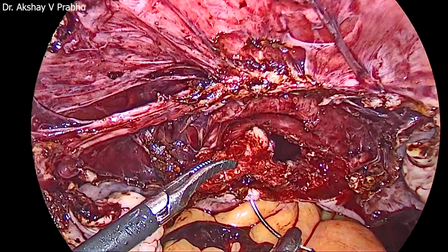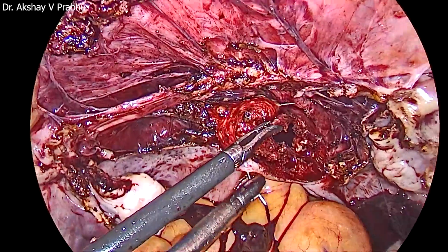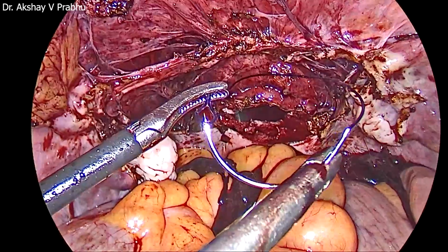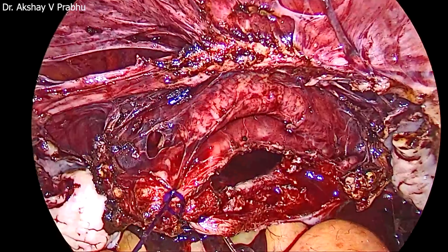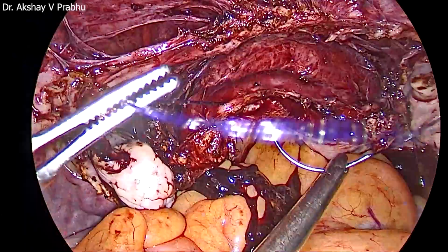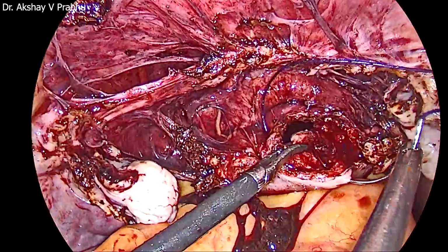Closing with barbed suture, 10, 15 centimeter. I prefer 15 centimeter. Barbed sutures are good because you don't need any assistant. There is no entanglement of the suture. The uniform tensile strength is maintained across the vault. There is no knotting involved.